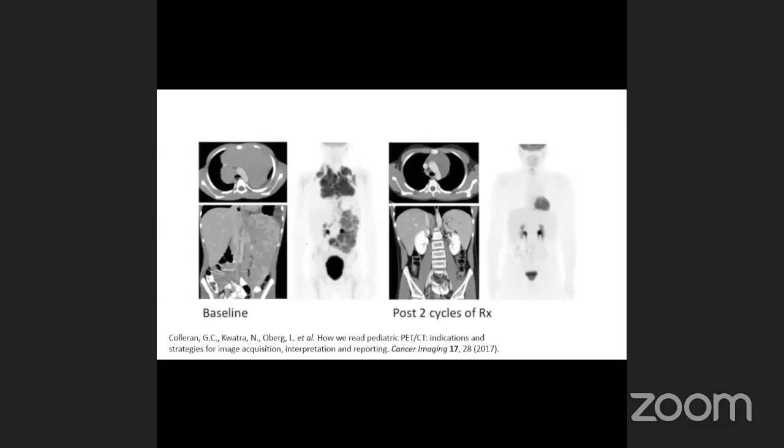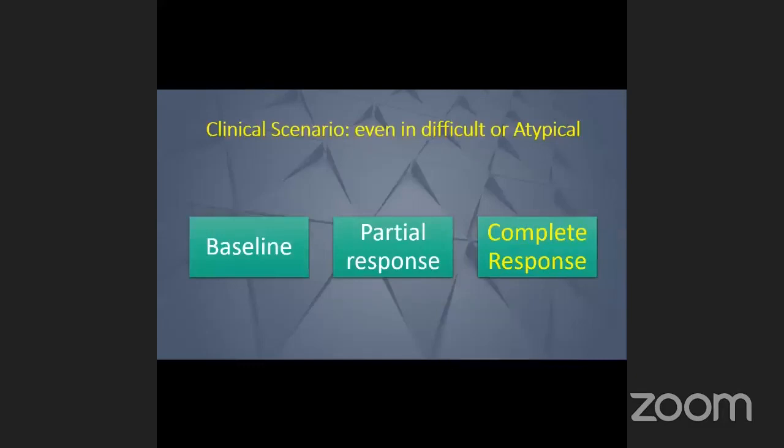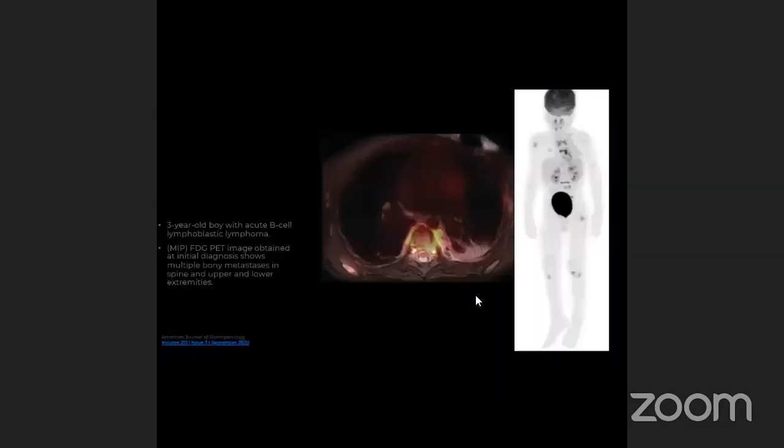And in this case, if you go to report just the CT and you don't have the PET side, you will say that this patient still has some residual. But in reality, this patient has complete metabolic response, CMR. Okay? Complete CR.